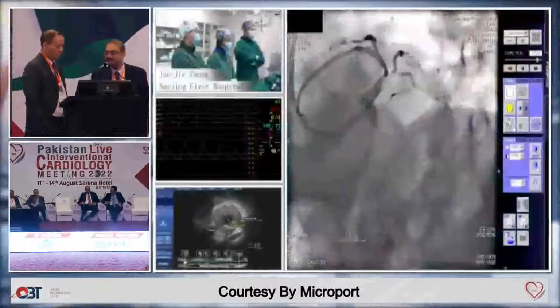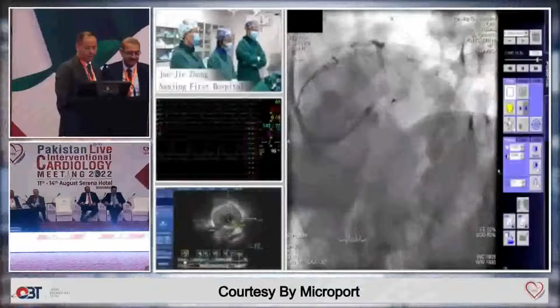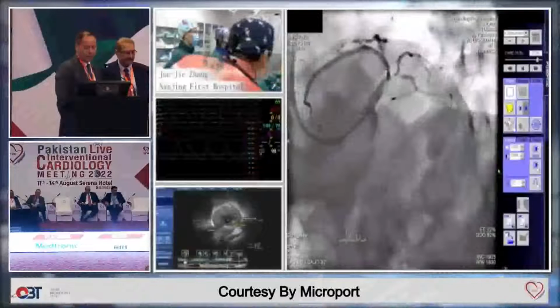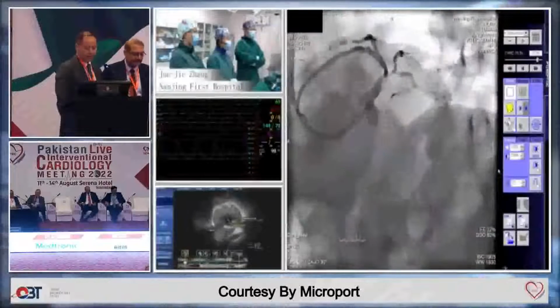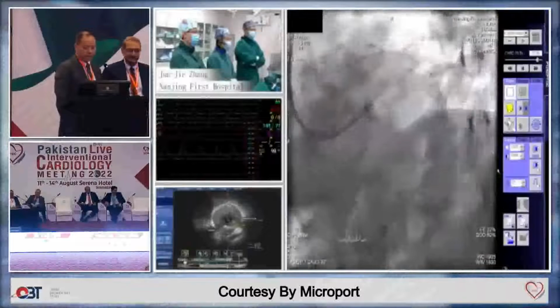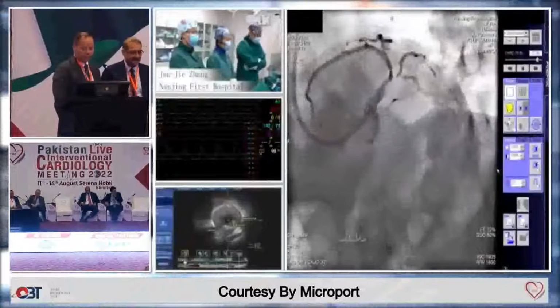Thank you. Now the angiography is zooming in, so clearly there is mild to moderate calcification in the proximal circumflex. So Dr. Zhang, do you plan to pre-dilate the circumflex first and then check? Yeah, Professor.